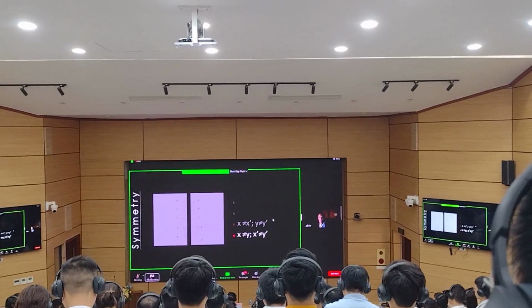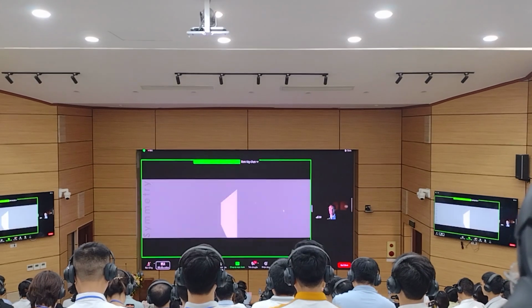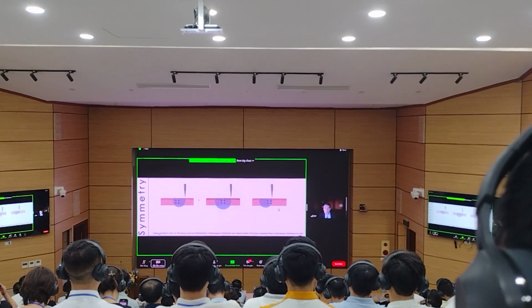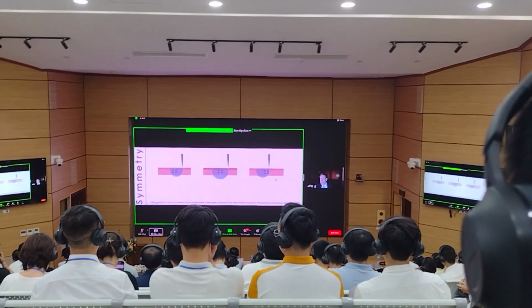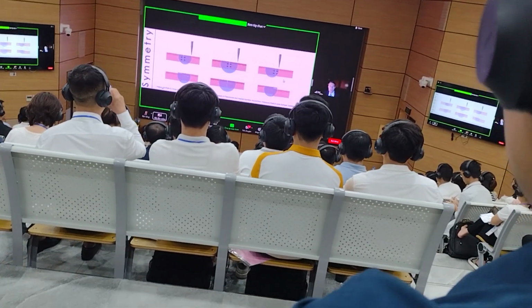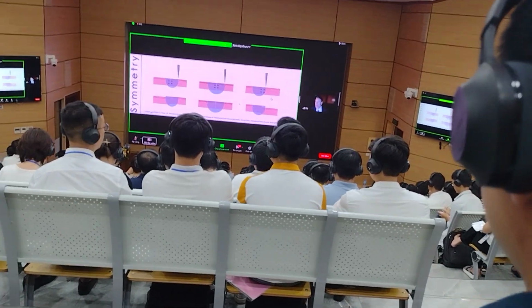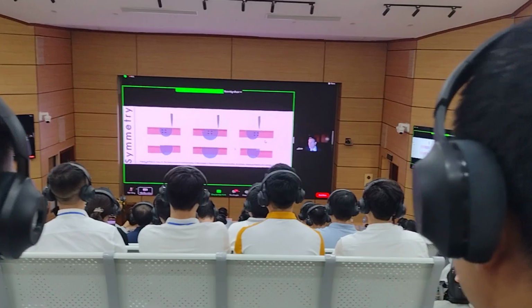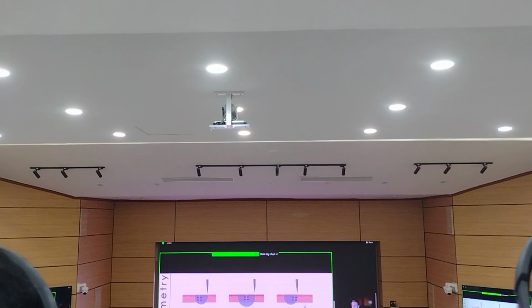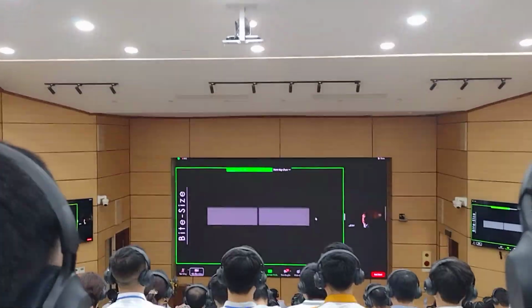And we're trying to avoid, of course, asymmetrical disposition of these sutures. And the reason being is that when we have discrepancies between our entry point and our exit point, for instance, right here and right here, and we bring those tissues together, there is the risk of producing eversion or inversion of those marginal wound edges, and that is going to translate into scars. It's going to translate into perhaps an unnatural healing, sometimes open wounds. So it is important to understand the entry point and the exit point.